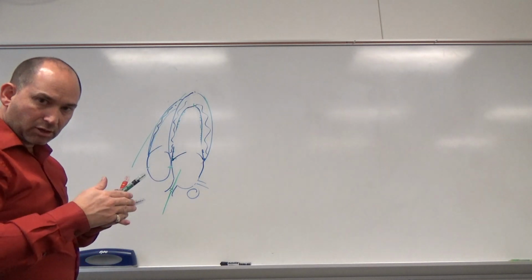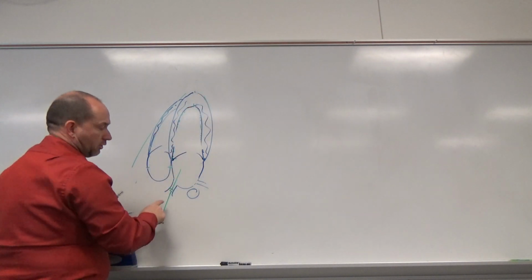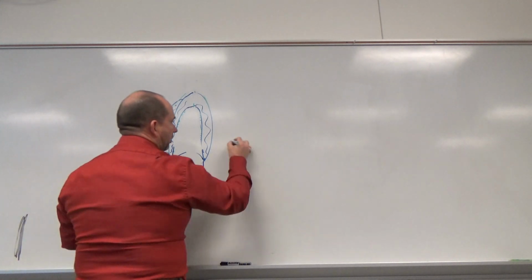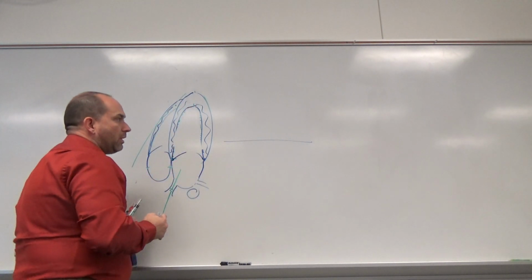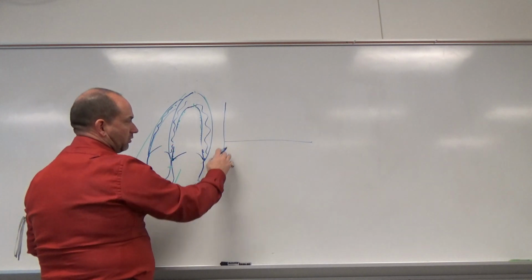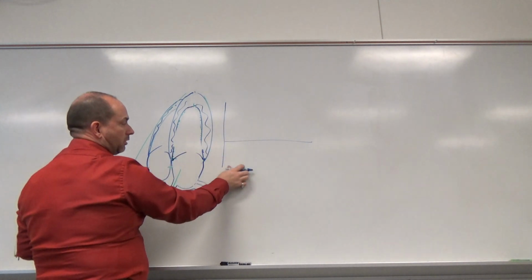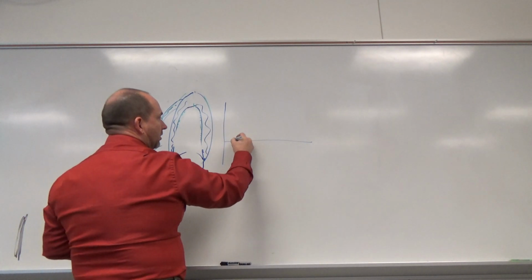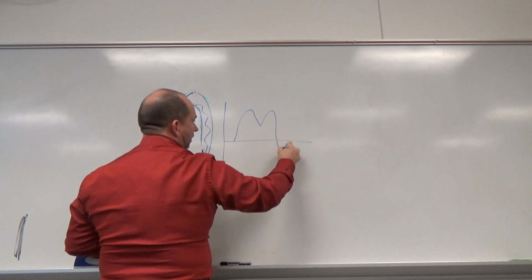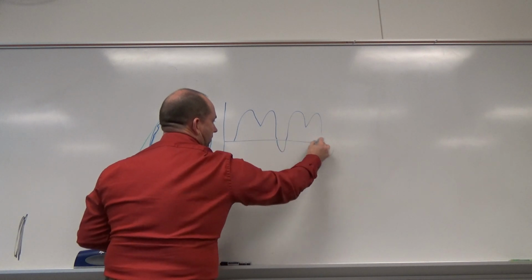You might need to come a little bit lateral, coming in from this side of the heart, angling through to see that really well. Then we'll draw out our waveform. If we got a sector size, or not a sector size, excuse me, the image size, we want about 2/3 on top of here, about 1/3 on the bottom, because we're going to get an S wave, a D wave, and an A reversal, and then it goes to S, D, A reversal again.